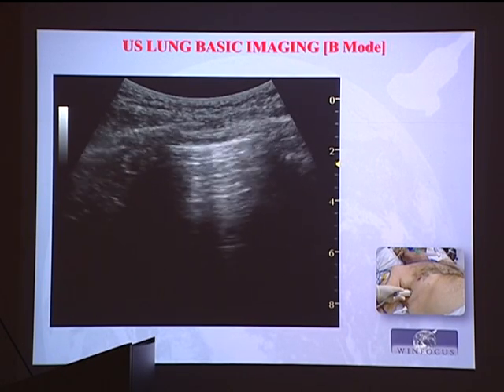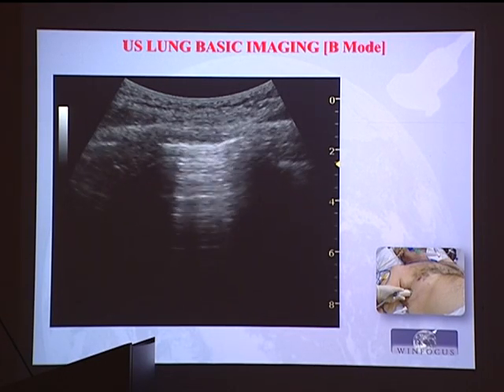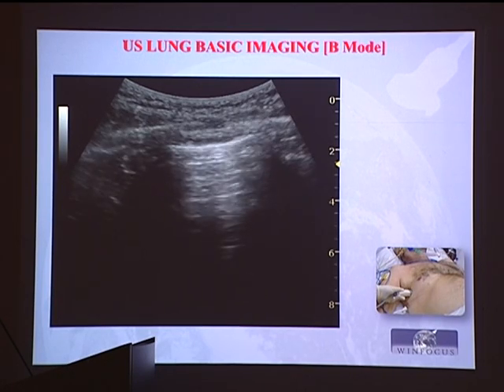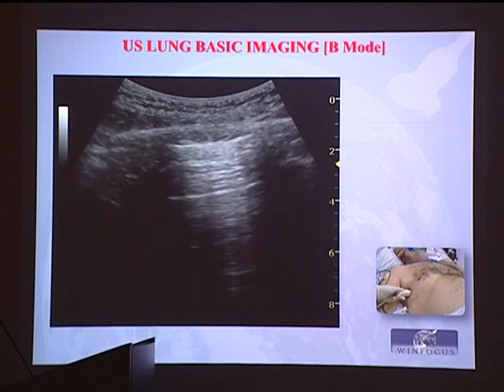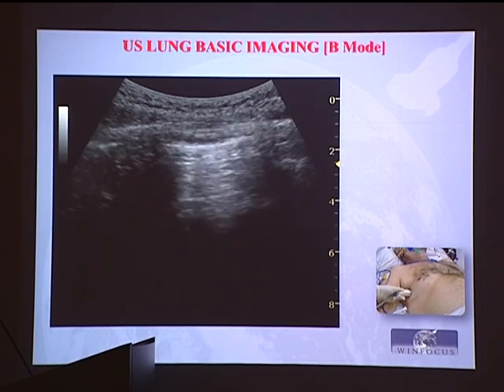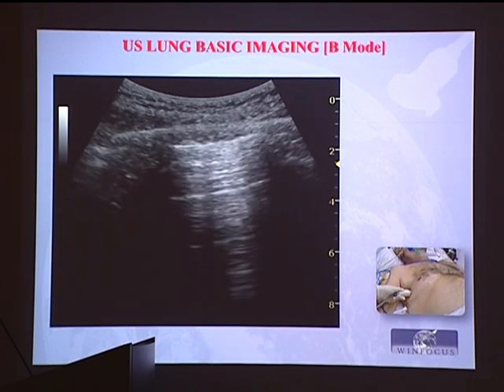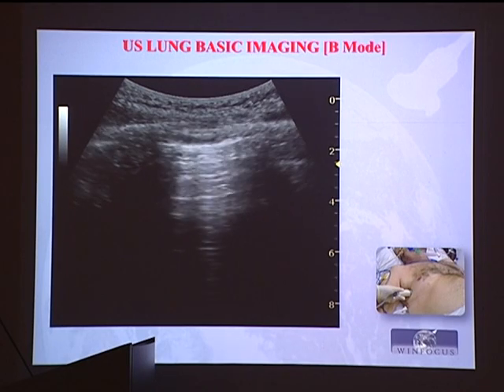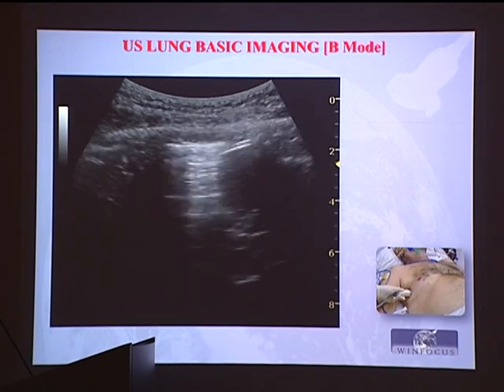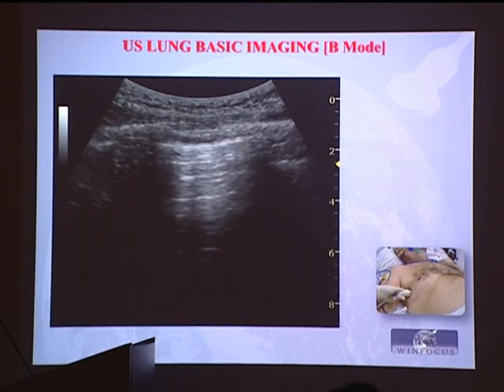Okay? So before starting to interpret the image, your second question, after is there an indication? Yes. Is my image properly acquired? Okay? What is to be properly acquired? Am I using the appropriate probe, with the appropriate machine, with the appropriate setting?